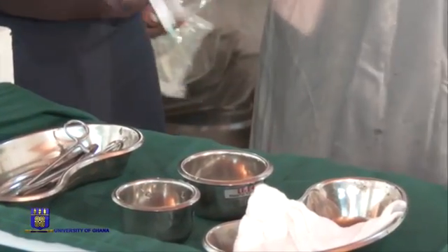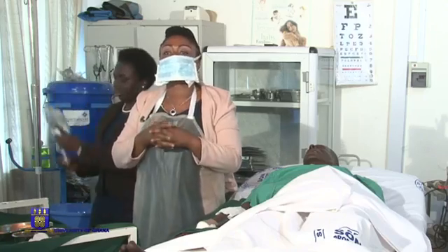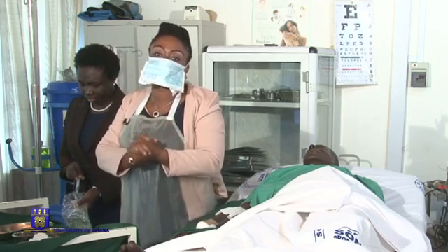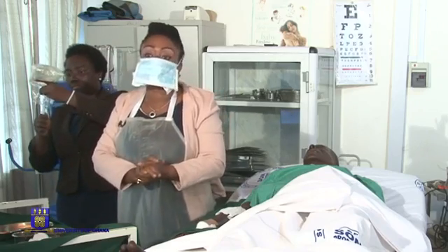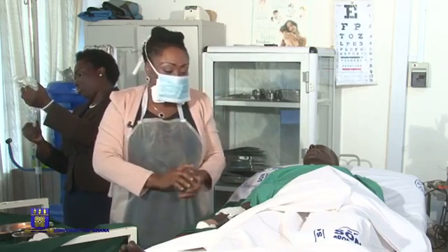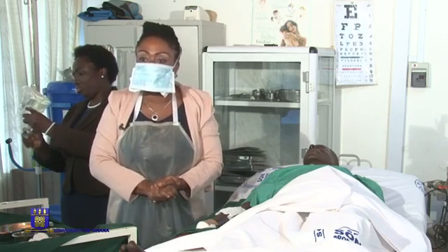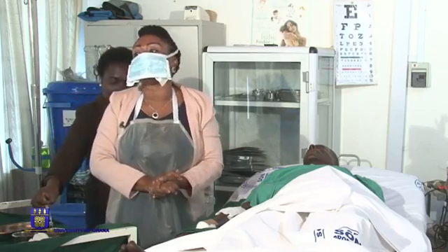The syringe is not supposed to touch any of the things on the sterile portion of the trolley because we want to prevent wound infection. 2 or 3 gallipots may be used depending on the number of solutions required for dressing the wound. For some septic wounds, normal saline is used, hydrogen peroxide is used in softening the slough, after which the wound is cleaned with normal saline and dressed with povidone solution. In that instance, then we will need more than 1 gallipot.